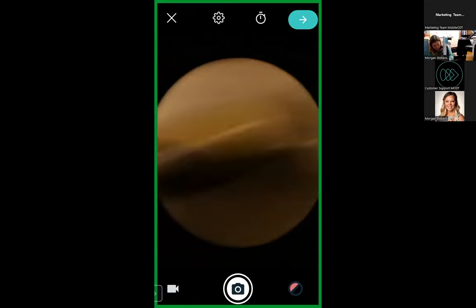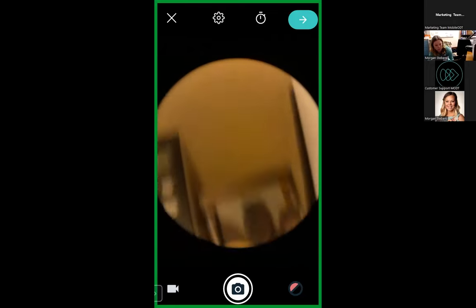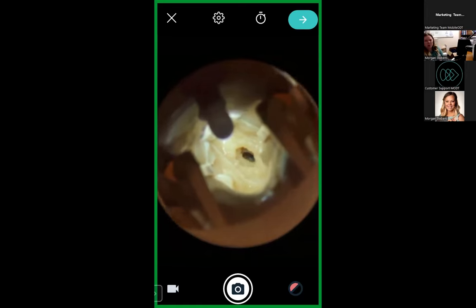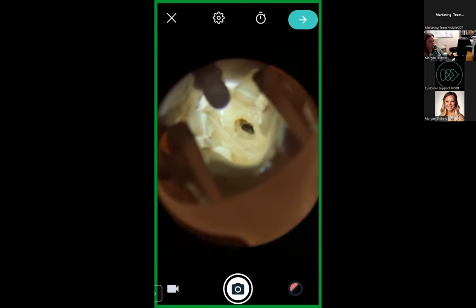But what I'm gonna do is adjust my stand so that I can see into my vaginal vault, and I just tightened it. Okay, now I am moving the one with the ball to look inside that vaginal vault. And I really wish I could see your faces or have heard what you did just then whenever it moved into the vaginal vault and really showed you exactly what you can see.